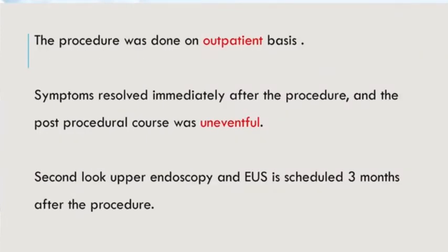The procedure was done on an outpatient basis. Symptoms resolved immediately after the procedure, and the post-procedure course was uneventful. A second look upper endoscopy and EUS is scheduled 3 months after the procedure.